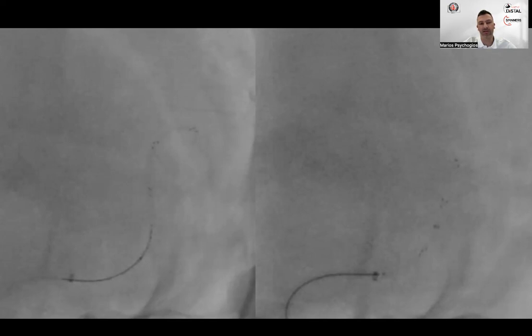If you do that, the advantage is that you can then work quadriaxially with a 3 French aspiration catheter. And again, I'm talking specifics now. The 3 Max, the 153, is available in Europe. And then you can work quadriaxially with a long sheath, a 7 French aspiration catheter, which is usually 130, then the 150, 3 French aspiration catheter, and then the long microcatheter. So then you will be working quadriaxially. Again, if you're working like this, you can start with 4 materials from the beginning.